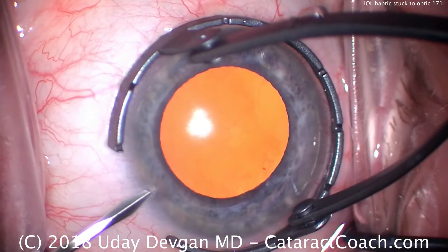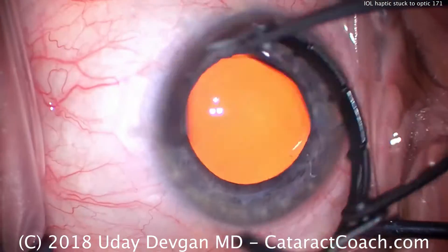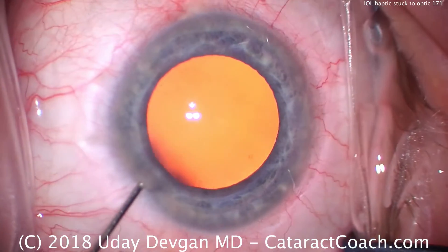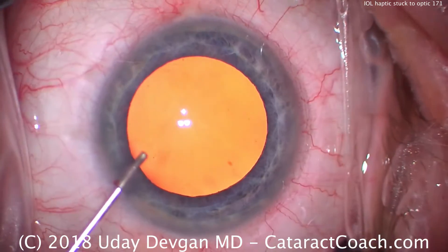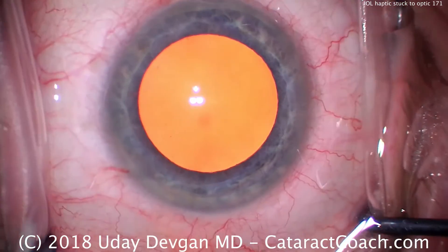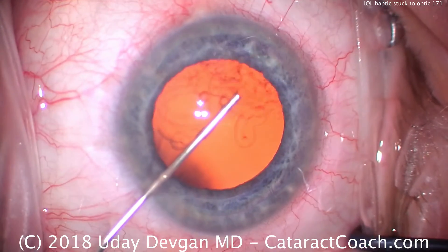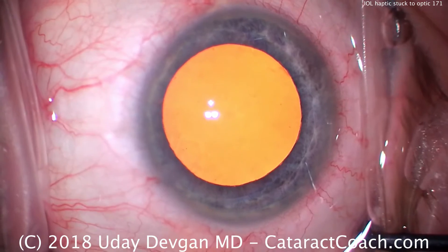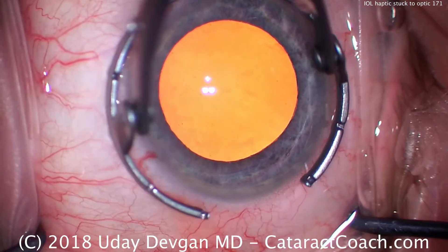CataractCoach.com — we have a routine case here which will proceed very well, but the issue is going to be once we insert the IOL into the eye and start to unfold it, one haptic is going to be stuck to the optic. What we'll talk about is what are our options at that point for releasing that haptic — we certainly can't leave it like that. If you want to skip right to that point, that's going to be the three-minute mark, go ahead and fast forward, but for those who want to learn, watch how we do the rest of this routine case.